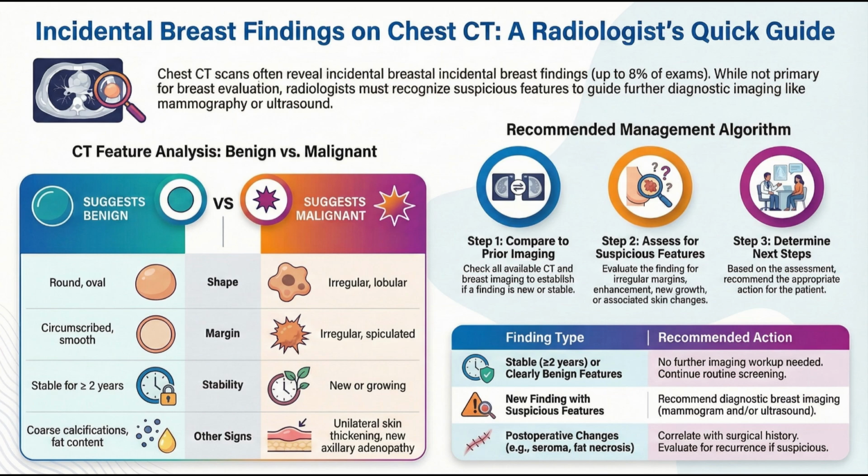That's a huge difference in approach. So if you're only using the CT measurement, you're probably less sensitive. You are. It's well established that CT is less sensitive and specific for finding metastases in nodes compared to a dedicated ultrasound. Which means context is everything.